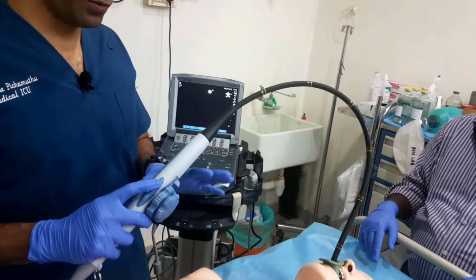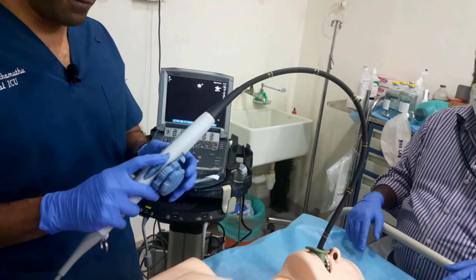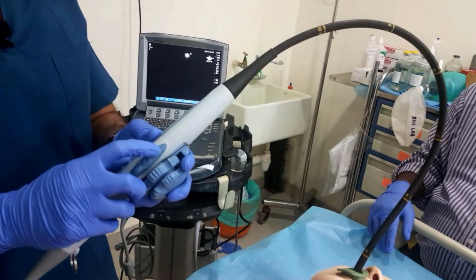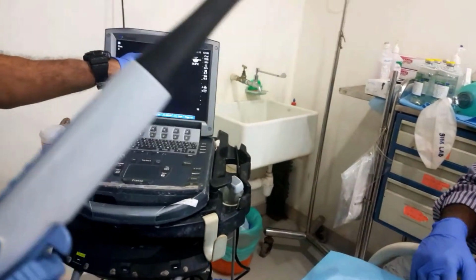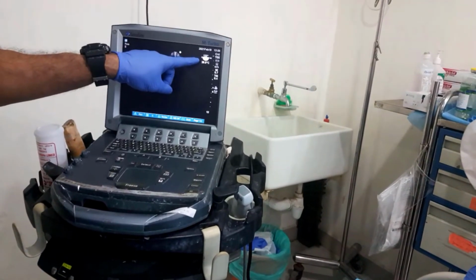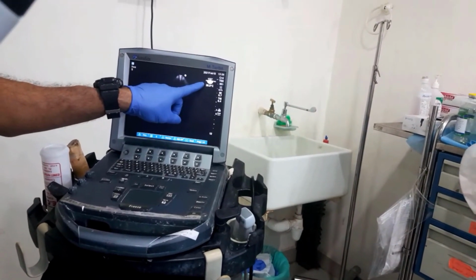The next view is the transgastric long axis view. In this view, we do not have to move the esophageal probe from its current position. All we have to do is change the angle of the beam. So I'm going to use one of these buttons and bring it up to 120 degrees. Okay, so it's 120 degrees now. So once you do this, you will now get the transgastric long axis view.